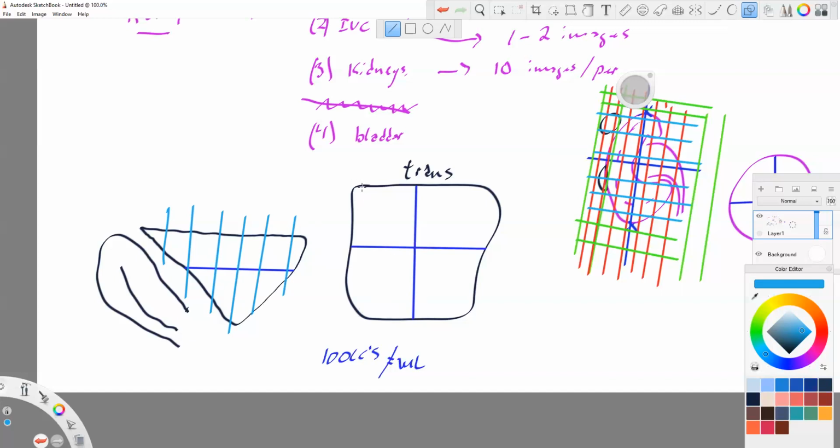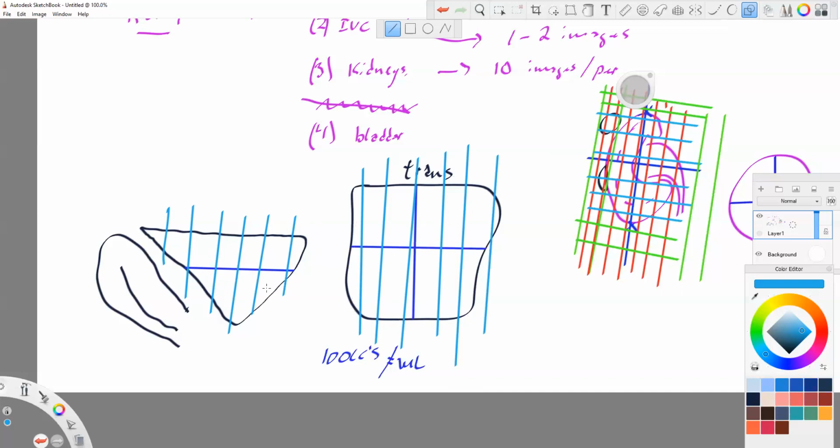No. So then my sagittal pictures would be kind of across. So probably more pictures than we really need on a bladder. The bladder is kind of a boring thing. So maybe I've overdone it on these lines. So maybe 1, 2, 3, 4, 5, 6, 6 to 8 images on a healthy looking bladder is fine. Plus your measurements, picture or pictures, if you need 2 pictures to do that.